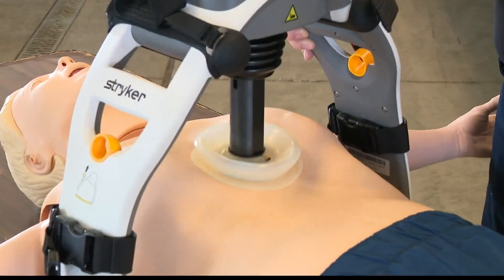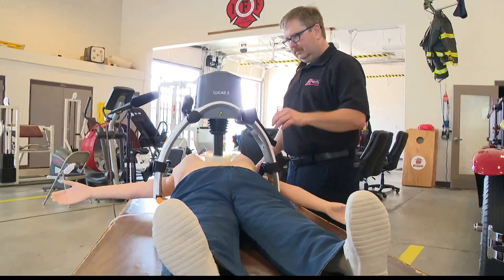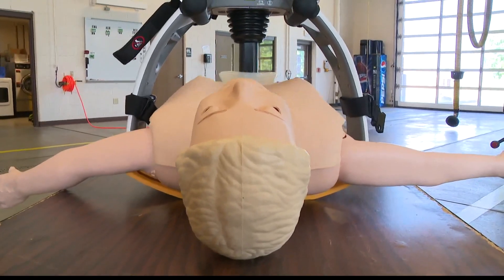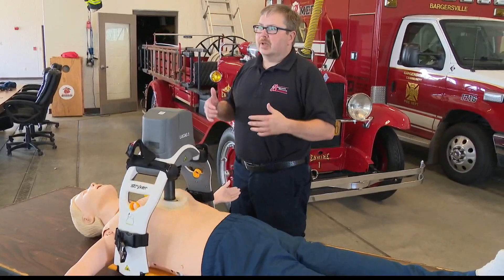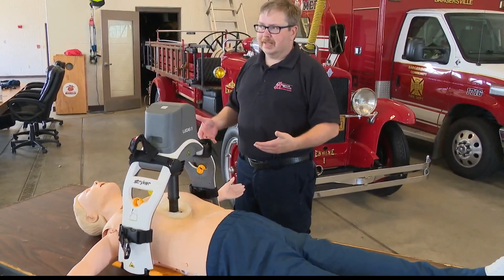Once the device starts, it begins performing mechanical chest compressions. The suction cup actually pushes down and pulls up on the chest — on the thoracic cavity — and increases blood flow. For someone whose heart is not beating at all or not beating correctly, this will allow their heart to continue to circulate blood even in a dire situation like that.